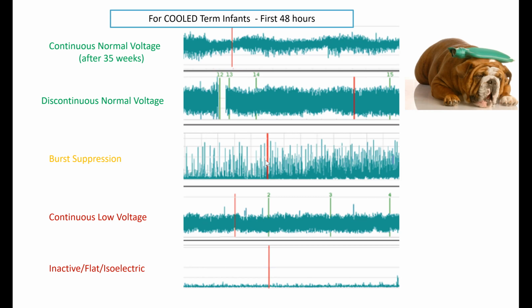And of course, it complements your exam. It complements everything else you're doing. So I'm not sure if that's answering or if that's helpful. Well, it is helpful. Medication can do it, but you have to correlate it to the story and to the exam and the other findings and imaging. It's just one piece of the puzzle, aEEG. Right.